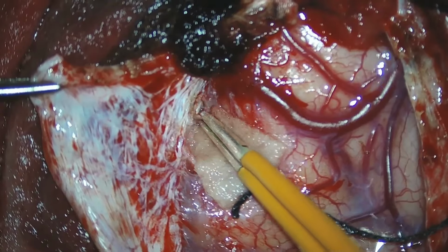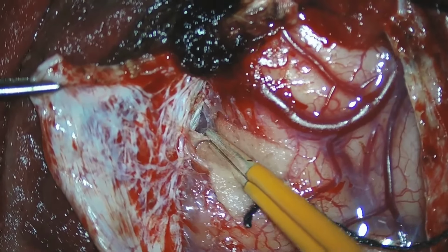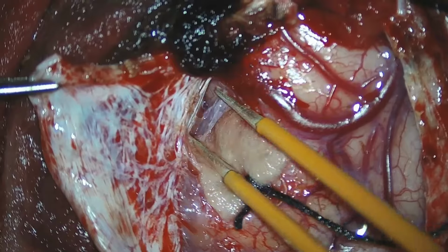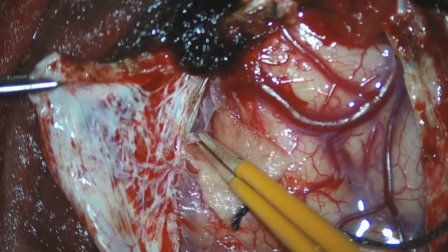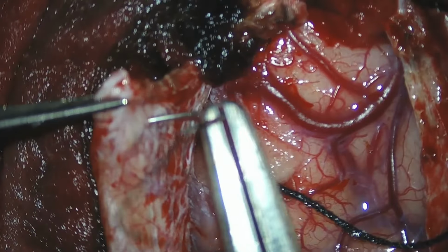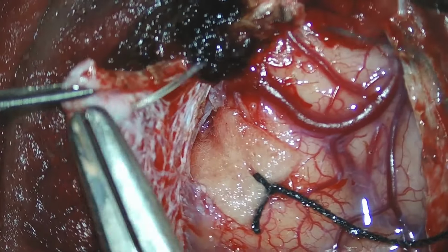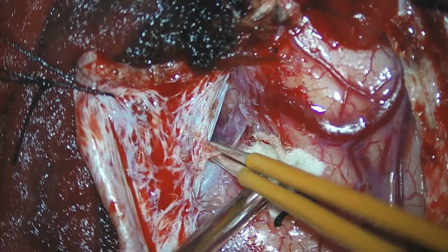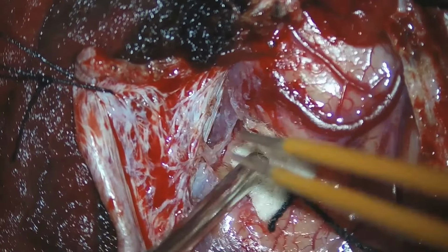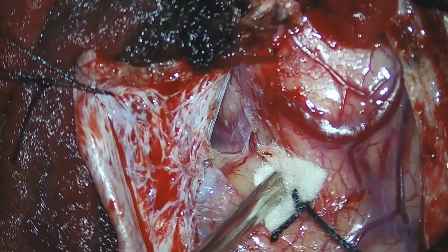We can see the arachnoid layer that is attached to the superior sagittal sinus, and we can also see the cortical veins. A traction suture was taken, and later the arachnoid is slowly peeled off from its attachment, and we can enter the interhemispheric area through this window.